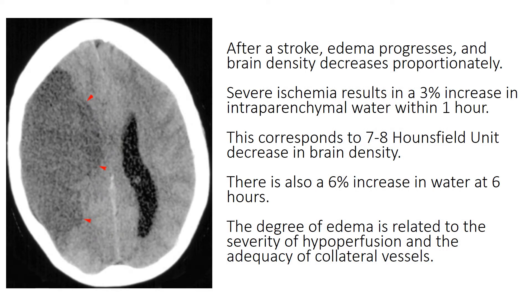After a stroke, edema progresses and brain density decreases proportionately. Severe ischemia results in a 3% increase in intraparenchymal water within 1 hour. This corresponds to a 7 to 8 Hounsfield unit decrease in brain density. There is also a 6% increase in water at 6 hours.